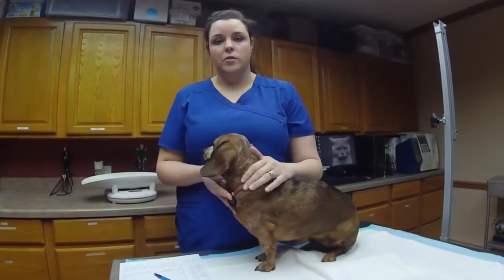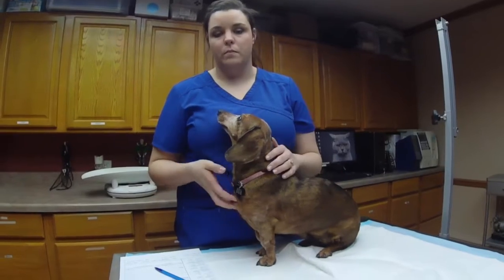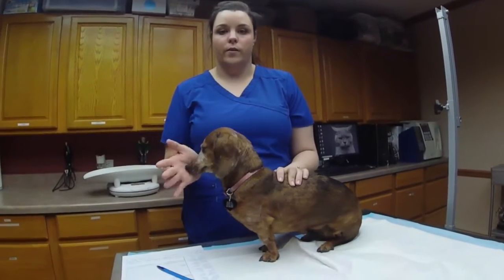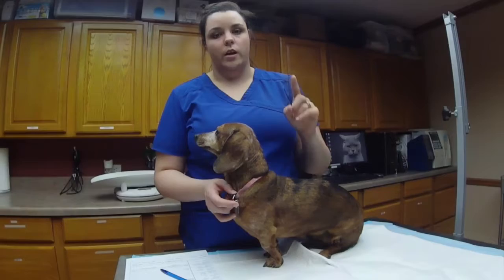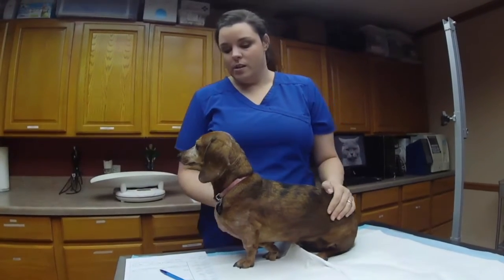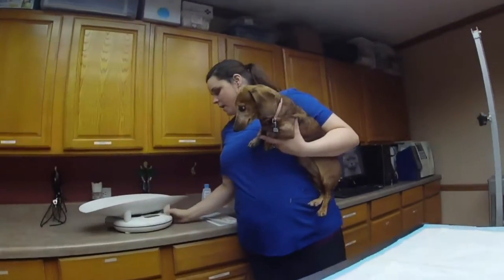This is how to do a proper physical before any surgery or when you do shots or anything. You're gonna go from the snout all the way to the tail. But we want to make sure that we do her temperature, her weight, and her respiratory rate. So let's start with her weight. I have a scale behind me.